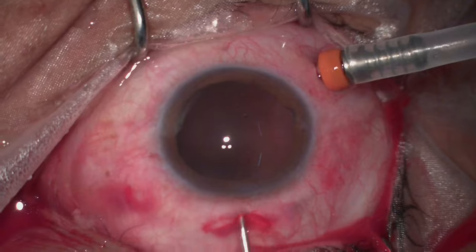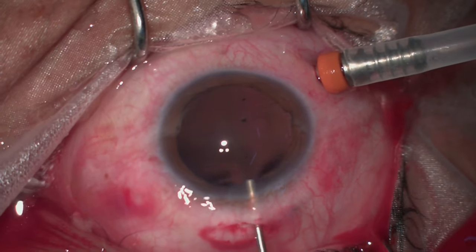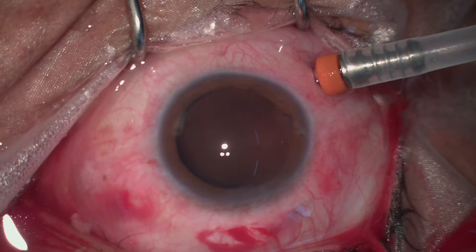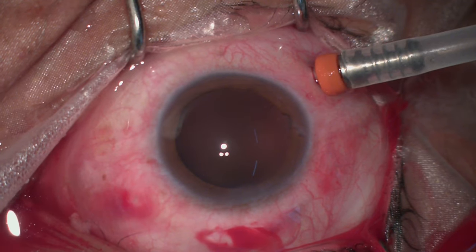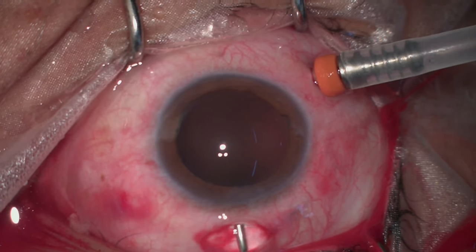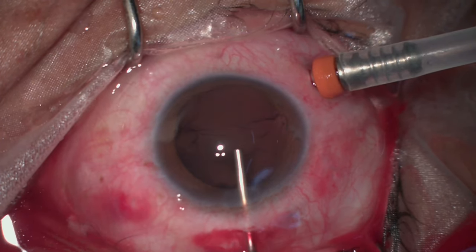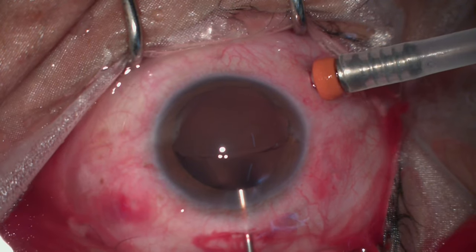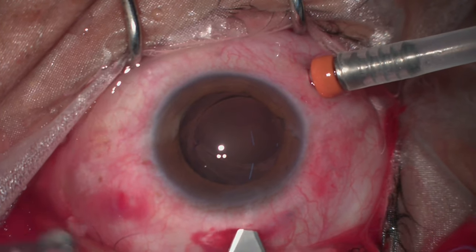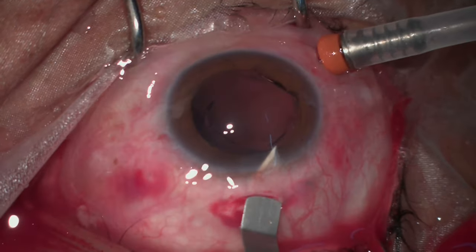Once the laser has been applied, we remove the trocar cannulas but retain the cannula with the infusion attached so that we can control intraocular pressure. The incision is then enlarged to accommodate the intraocular lens.